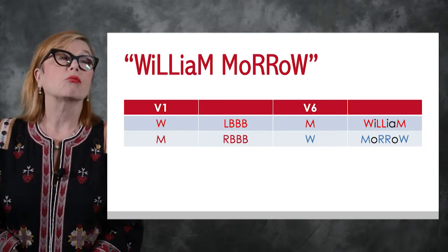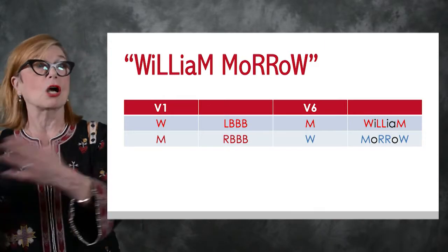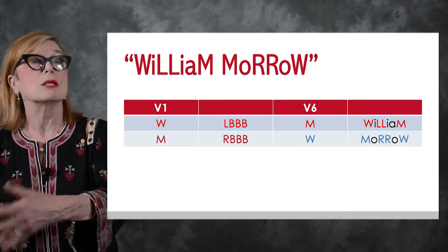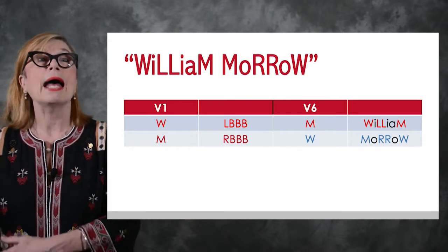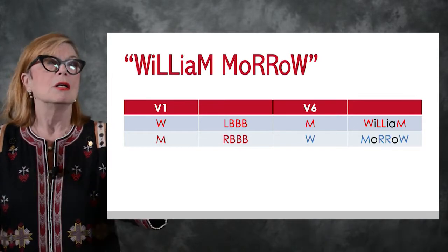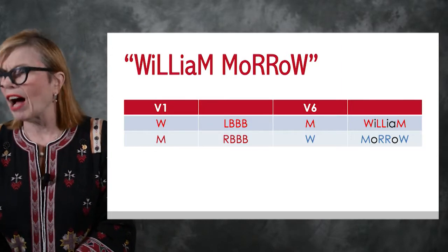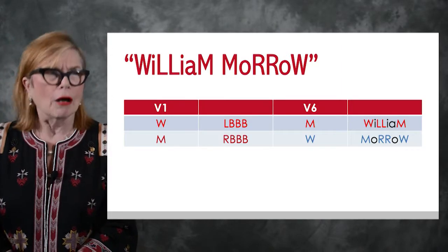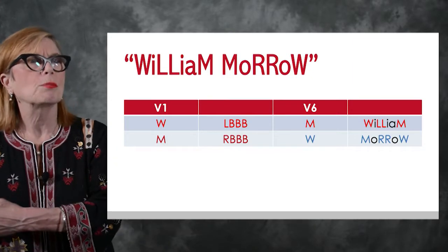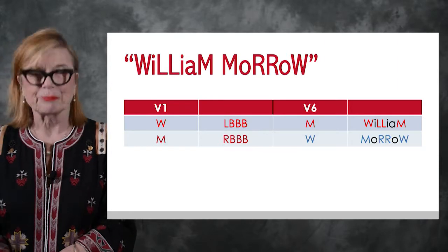Now, with a right bundle branch block, you'll have a double up in V1 because it's going to the right to depolarize the right bundle, and away from the left. So going to the right, away from the left. So that can help you. It's a very simple mnemonic. I'm not particularly fond of mnemonics, but I want you to understand bundle branch block simply, and then we're going to look at it more complexly.